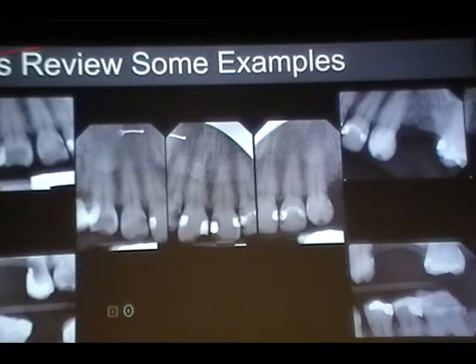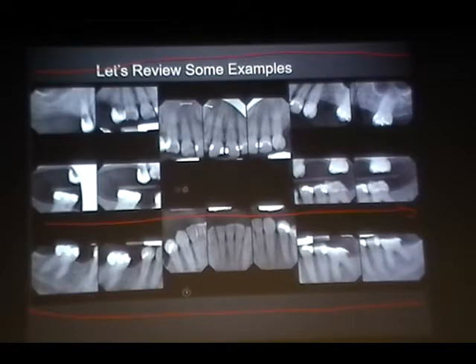So that looks pretty good because you want to see 10 and 11 open contacts. That's all your goal. Yes, we do see that. And there is a cone cut, right? How about this one?